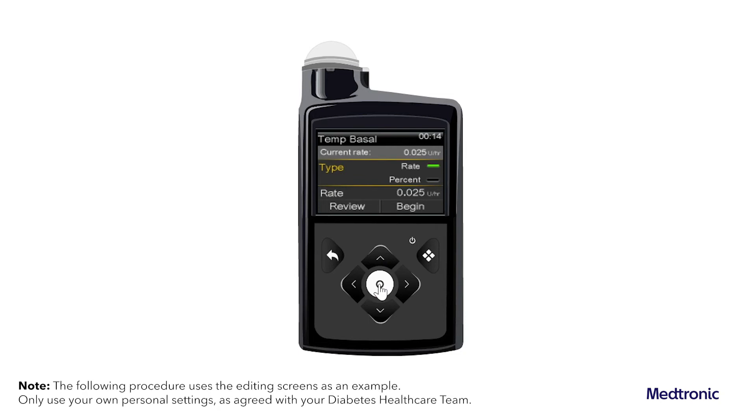Depending on the type selected, do one of the following: enter a percentage, or enter a basal rate.